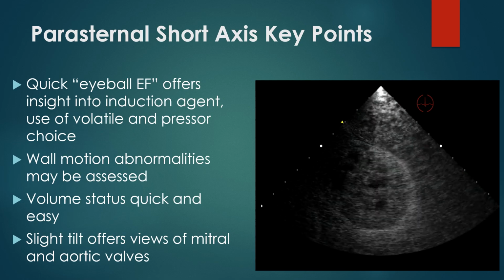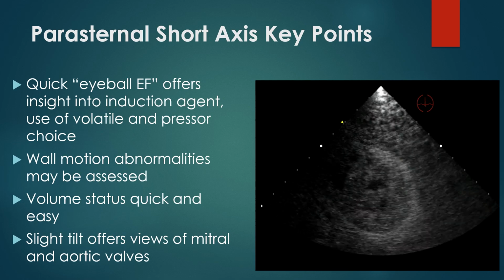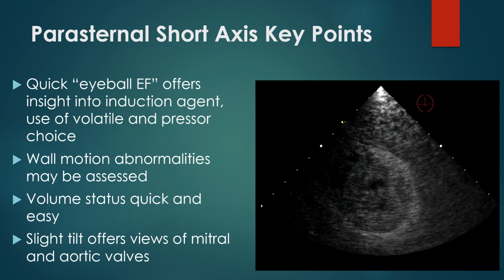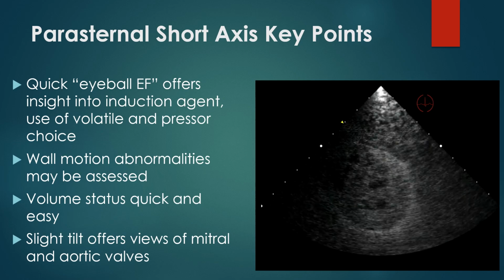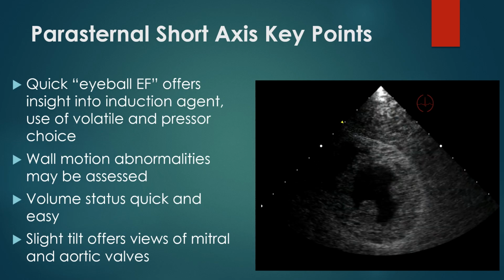And a slight tilt offers views of the mitral valve. And then if you push it a little bit towards the sternum and go a little bit more cephalad, you can get a nice view of the aortic valve as well. Again, we're talking 6 different positions with the FADE exam, but you can carry it out as far as you want, and you'll find that this is a very good tool, and you probably will never use your stethoscope again.